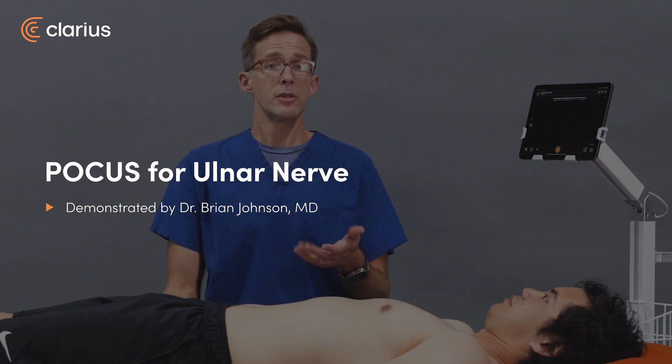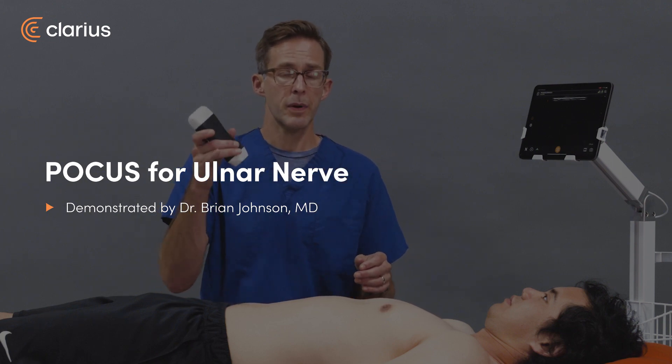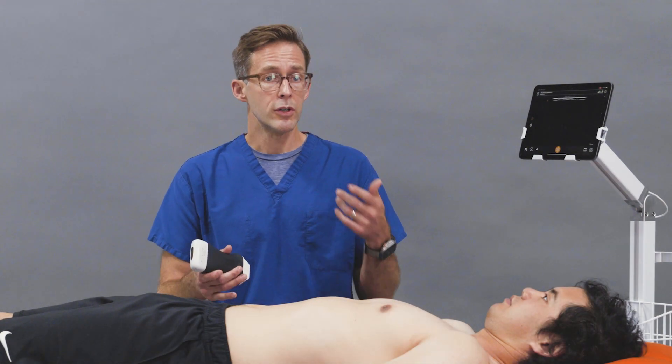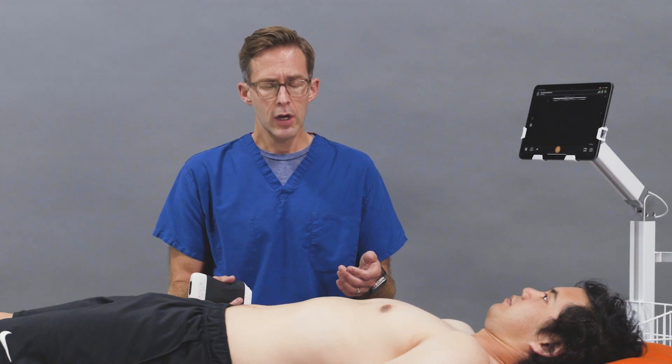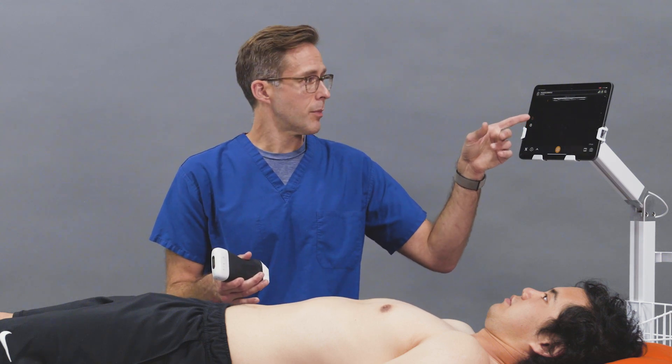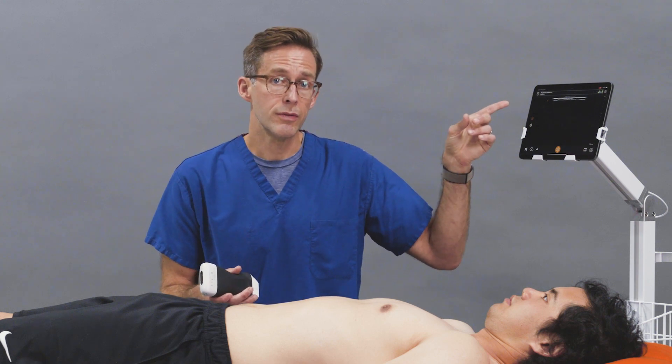Hello, I'm Brian Johnson. I'm an emergency physician, and today we're going to use the Clarius PAL to identify the ulnar nerve for an ulnar nerve block. You have the patient lying supine, forearm extended, and you're going to have your Clarius set on the nerve setting.